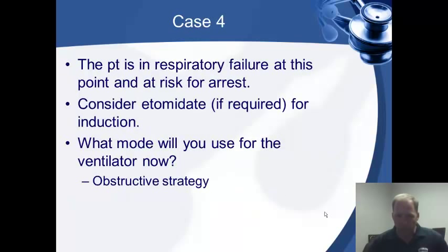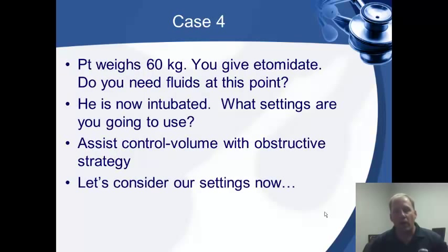Well, the patient's in respiratory failure at this point and at risk for arrest. You want to consider etomidate or Versed and get the patient intubated so you can ventilate him effectively and continue to give him the medications that he needs. So you want to put him on the ventilator. What strategy are you going to choose? You're going to choose the obstructive strategy based on a COPD presentation. Okay, he weighs 60 kgs. You give etomidate. Do you need fluids at this point? Probably not right now, but we want to keep that on the back burner.